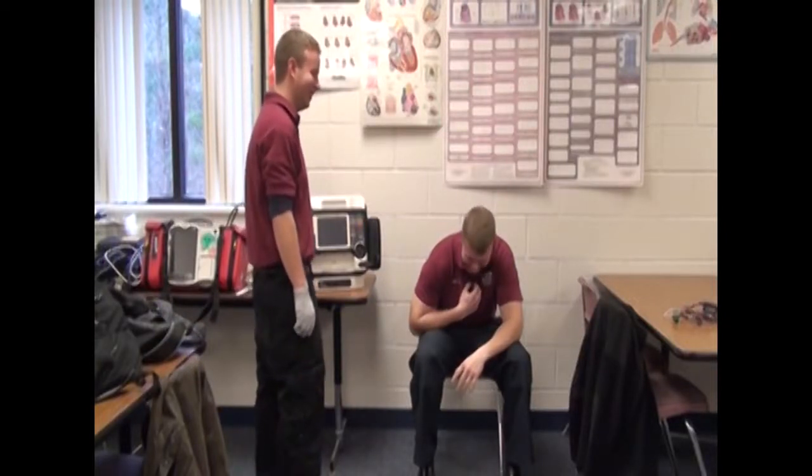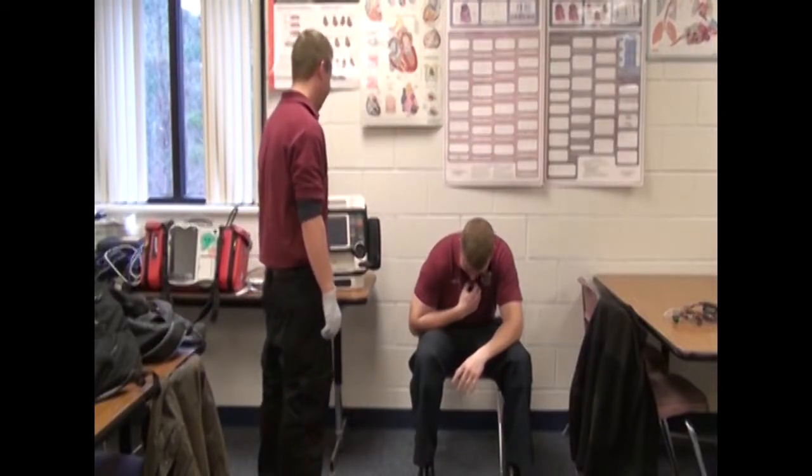Zach does his appropriate assessment. He talks to Josh just to tell him that he's going to put the 3-lead on him. You can go over there and talk to him a little bit.